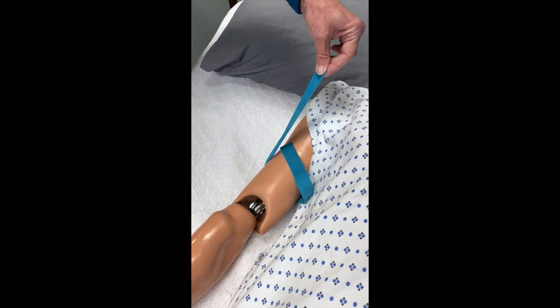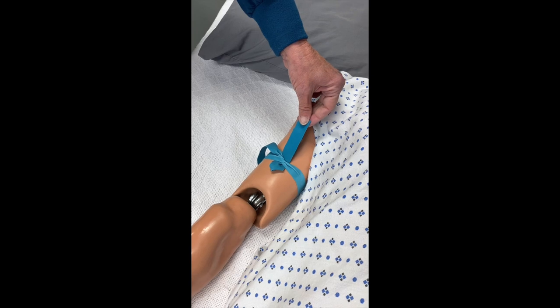Step four: to release, gently pull the top part of the tourniquet.